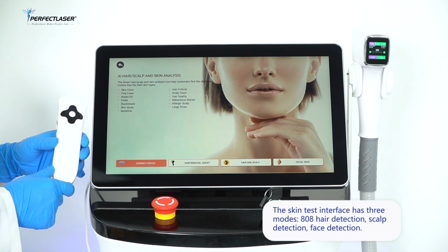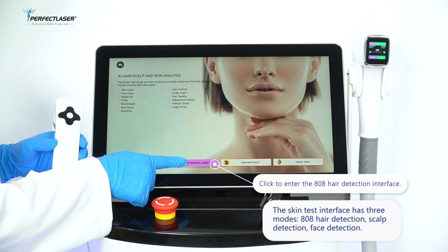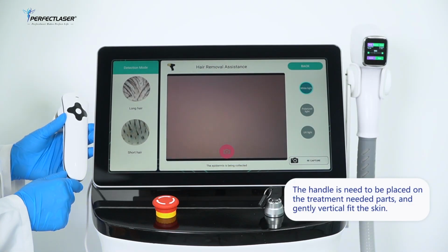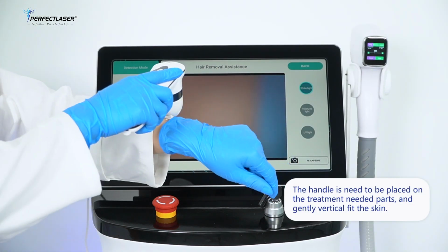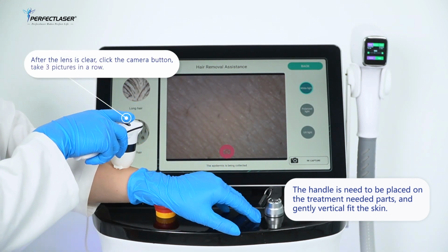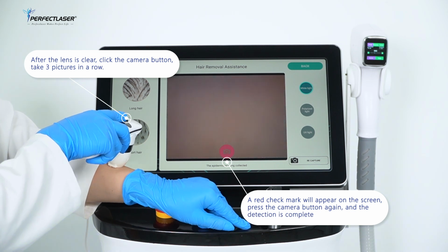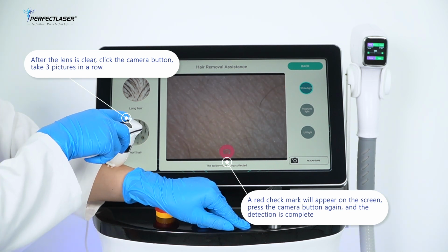Enter the skin test interface. There are 3 modes. Click to enter the 808 hair detection. Enter the interface. Place the handle vertically and gently on the treatment parts. When the image is clear, press the camera button. Continuously shoot 3 pictures. The screen appears red check mark. And then click the camera button. The test is completed.